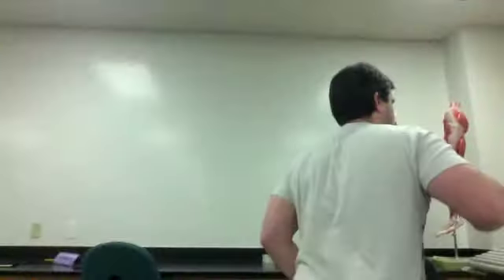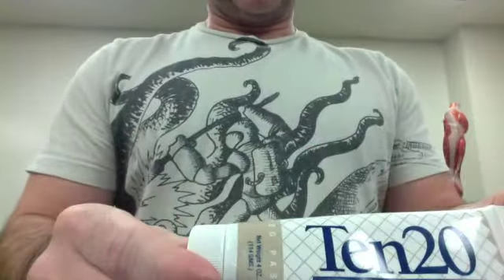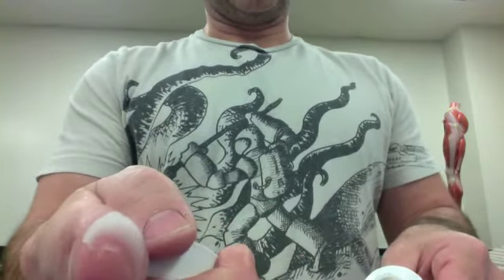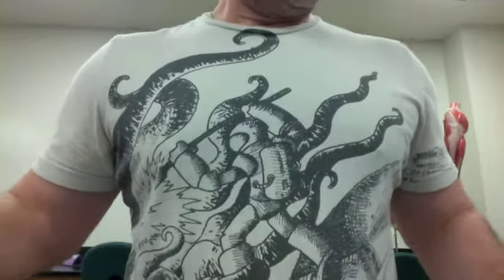Sometimes that's not enough, right? Sometimes that's not conductive enough. In order to get around that, we have a gel, which I'm going to grab here. You can take a little bit of this gel. It's clear. Basically, it has electrolytes in it. I can put a little bit on my finger. Sometimes this has a consistency of Vaseline, sometimes it looks a little bit more like a hair gel. But whichever type of gel you use, you just put a little bit of that on the pad, and that should help in your measurements.